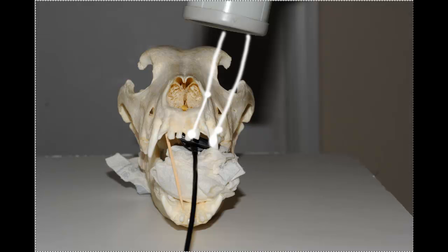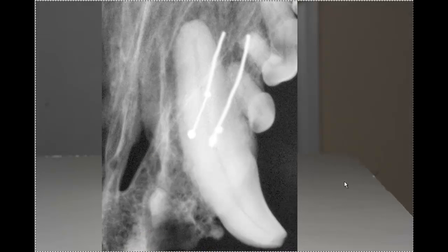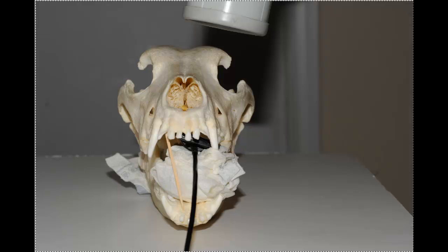So we would then see something like this as a typical radiograph of that, this being the 204 upper canine. Cool thing about this is all we have to do to get the 104 is move the sensor over to here and come in with our x-ray at about 11 o'clock. And we would get the same thing on the 104. So this works fairly well for that.